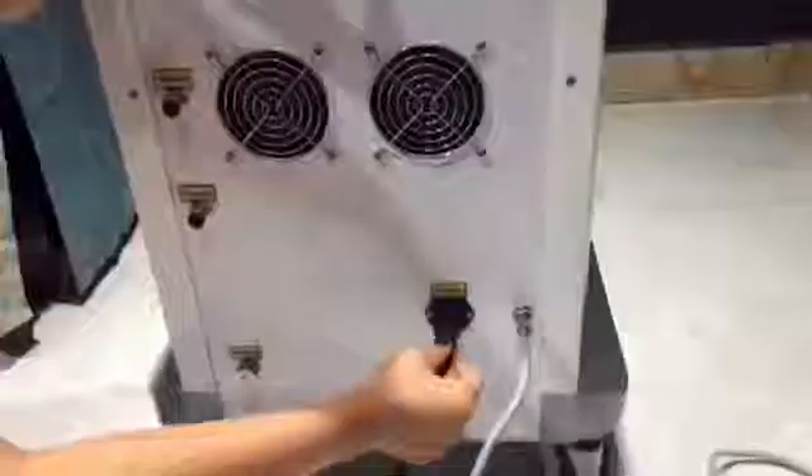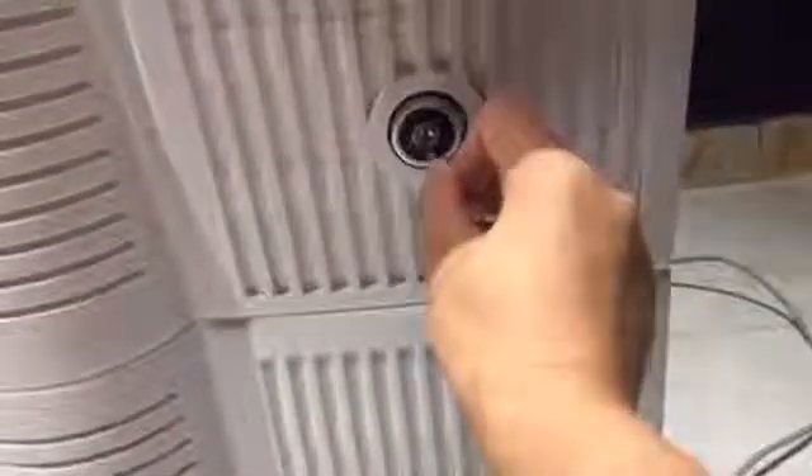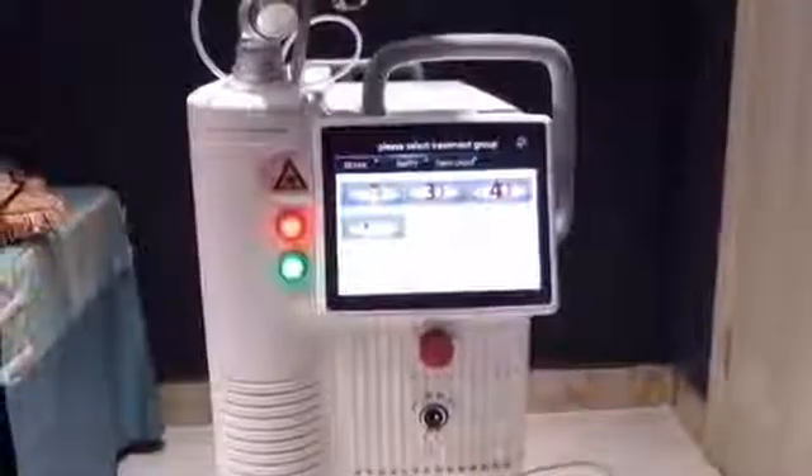Connect the foot pedal, connect the power cord, and insert the key switch to turn on. You will see the screen display.